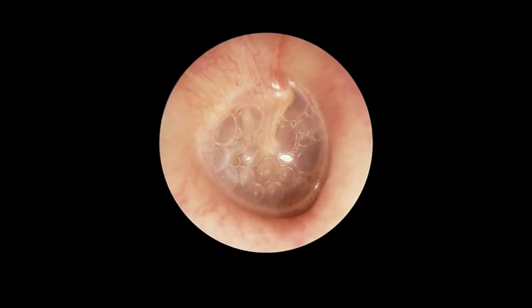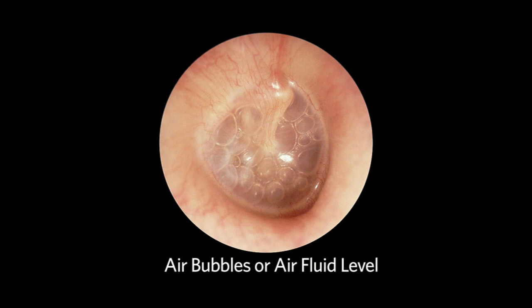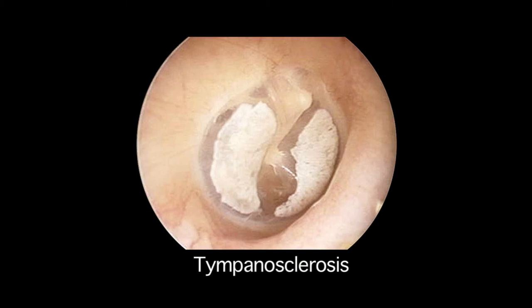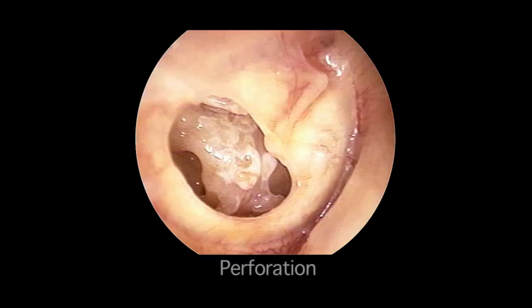At times, one might see air bubbles or an air-fluid level. The tympanic membrane may have scarring, commonly known as tympanosclerosis, or it may have a perforation.